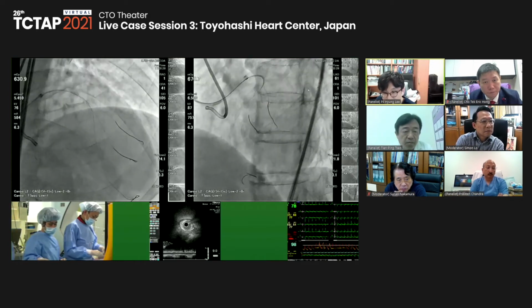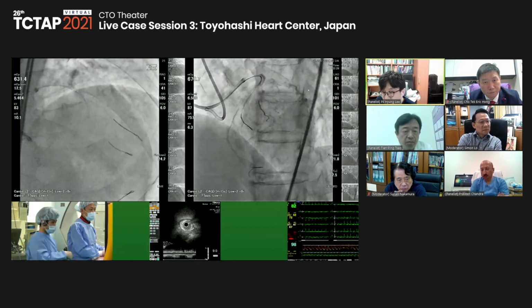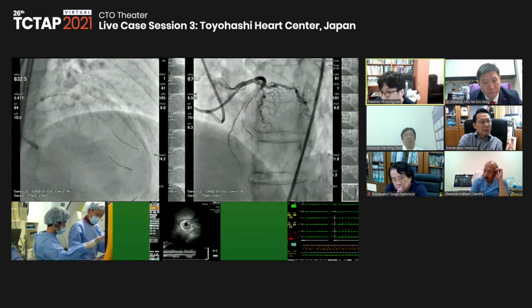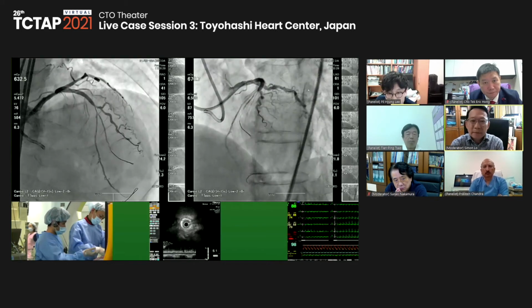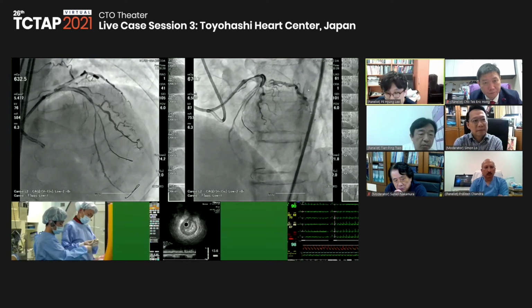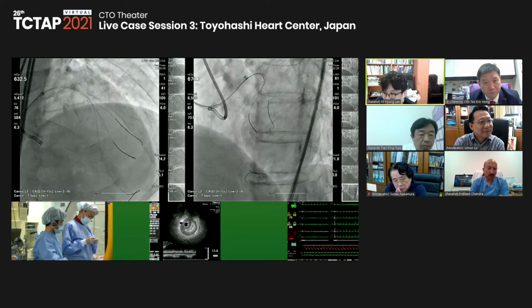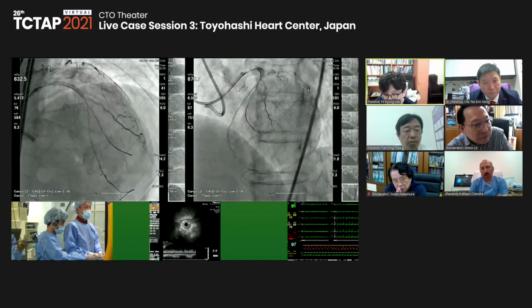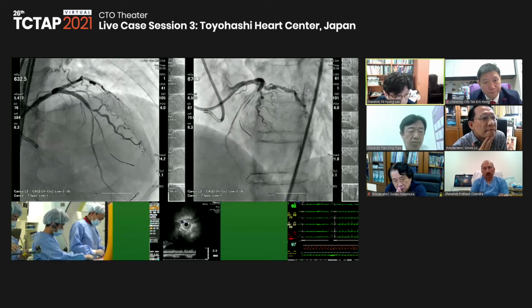I would like to land the stent at the negative remodeled vessel, but just overdilate about 15 or 20% very carefully. And after that, depending on the final result, I would like to have a second look a few months later to see the stent apposition or the distal vessel status.